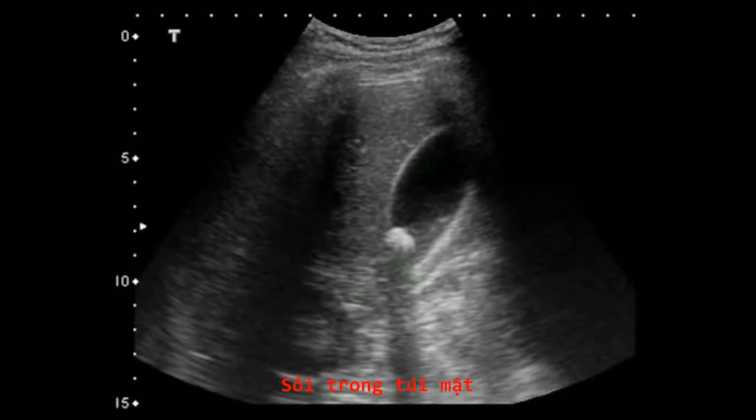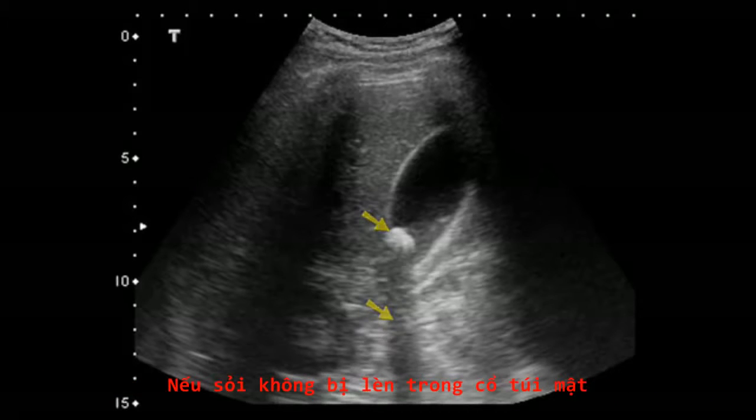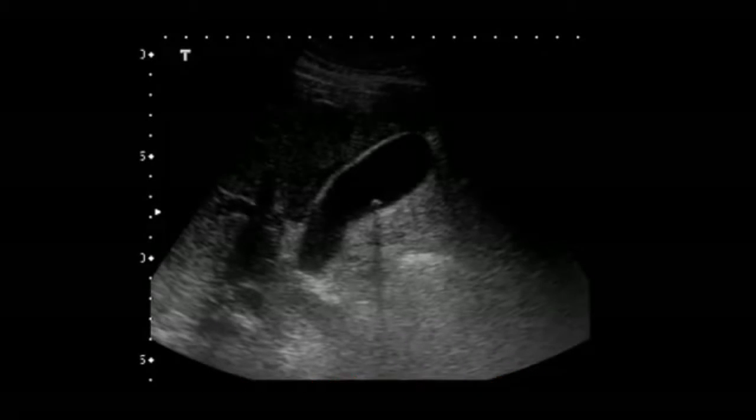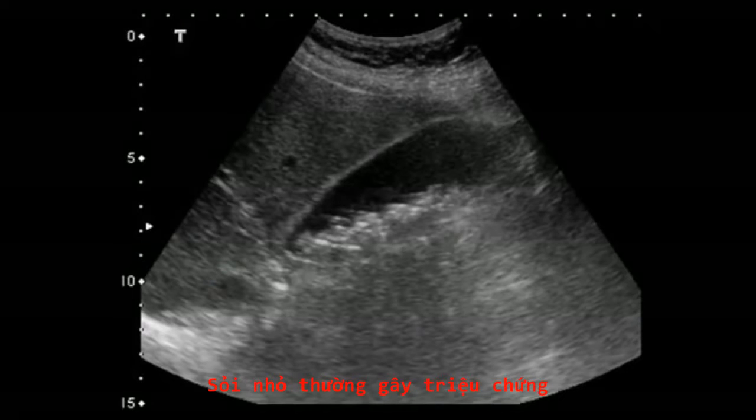Gallstones in the gallbladder generally appear as hyperechoic structures with significant shadowing. If they are not impacted in the neck of the gallbladder, having the patient change position should show free movement of the gallstones. Gallstones range in size from small to golf ball size. Smaller stones are more likely to cause symptoms by becoming obstructions.